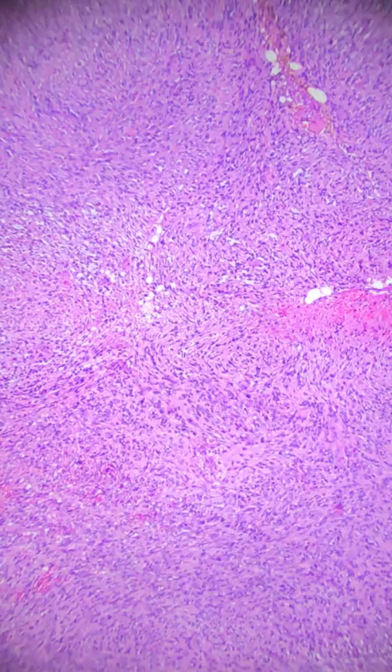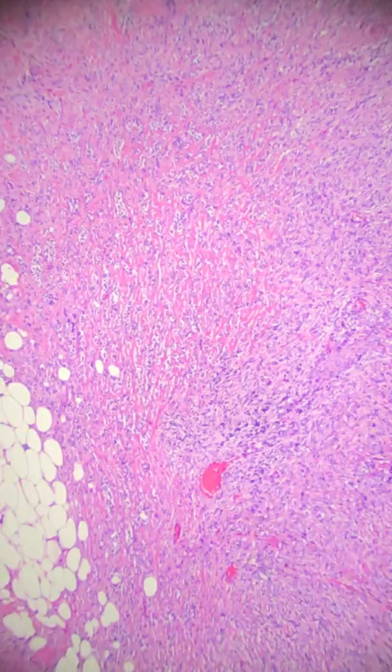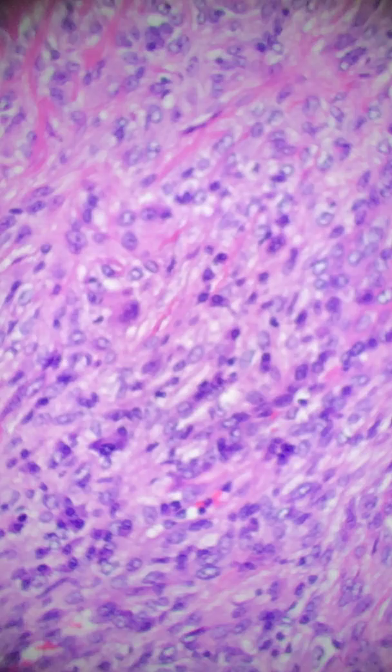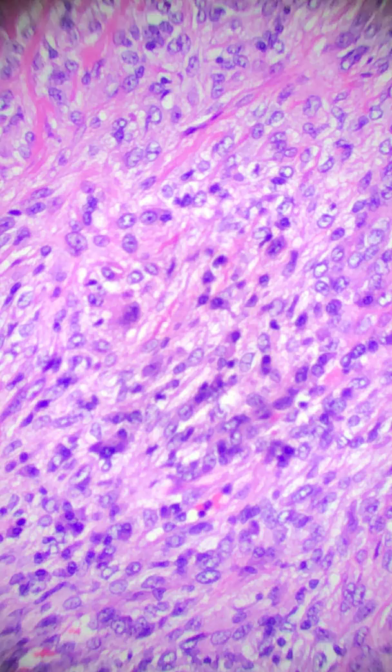But because these are rare, right? We mentioned less than 5% of all invasive cancers. What are the true prognostic implications of a tumor like this? There's some suggestion that some of the metaplastic tumors, like the adenosquamous, might have a better prognosis. Look at this, some of the cells just kind of pop out at low power, so even at 10x you can see we've got a little more pleomorphism. But there's not a lot of data on these, and we've had a few of these come through lately, so it's just nice to be able to review these for you guys.